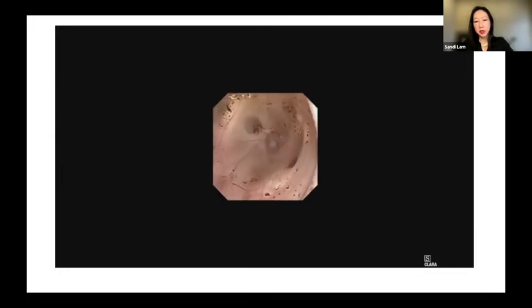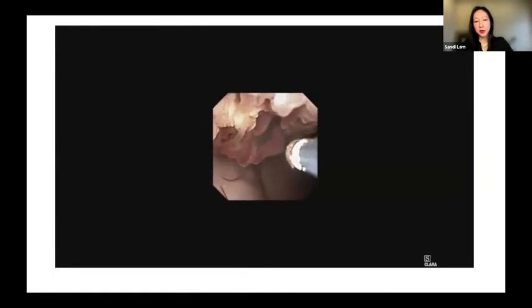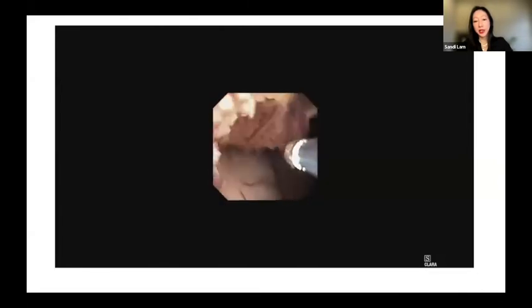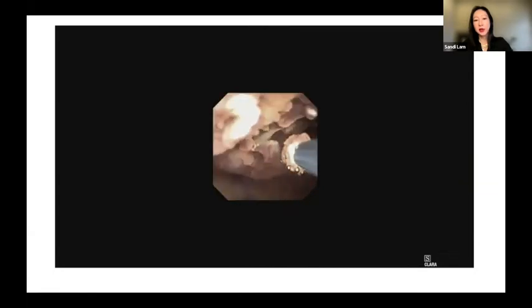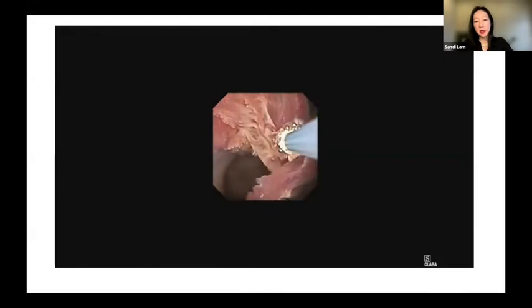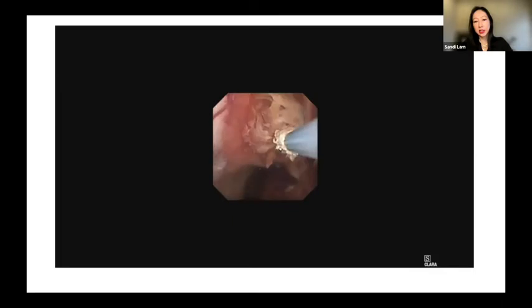Usually these are cases with very good hemostasis and good visualization. This is the choroid plexus cauterization portion where you do connect to power now for the cautery. You take your time to make sure that you don't cause bleeding, but you cauterize the choroid plexus very thoroughly from the lateral ventricles, the atrium, and into the temporal horn as well.